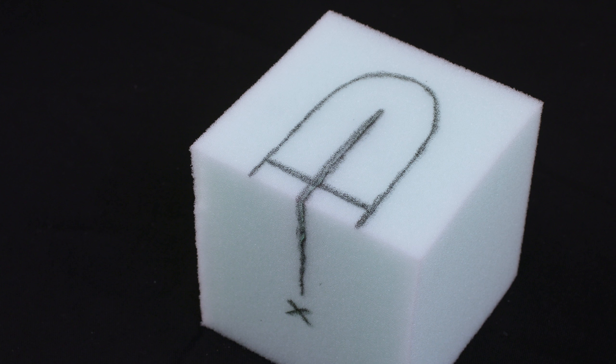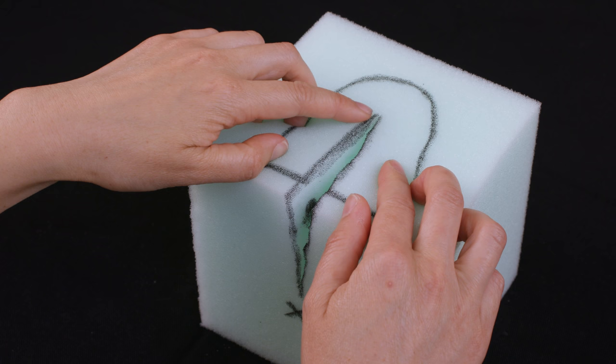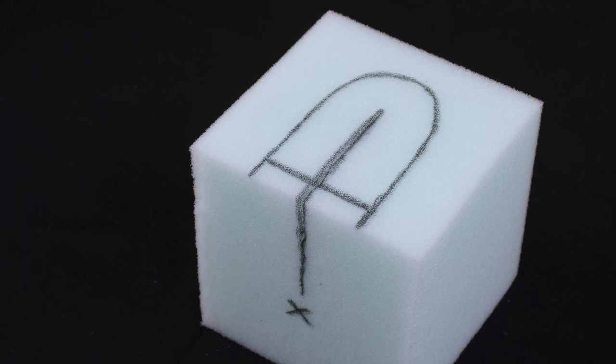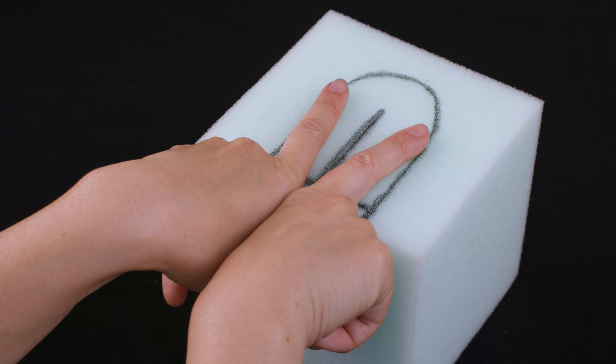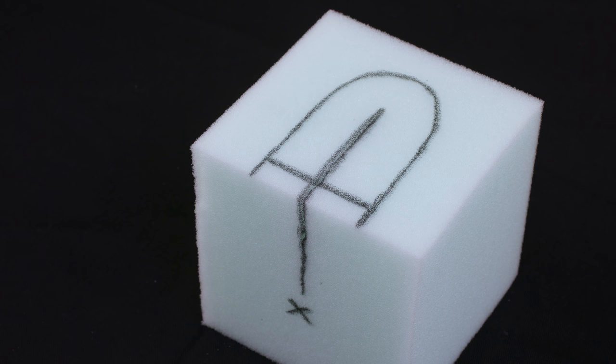Okay, let's begin. Identify the apex of the laceration. Use your sponge to wipe away blood to clearly see the apex. In deeper second-degree tears, the tear often occurs in a V-shape and there will be two apices, right and left. In these cases, choose to repair one limb of the V first and then restart from the apex of the second limb and continue repair.